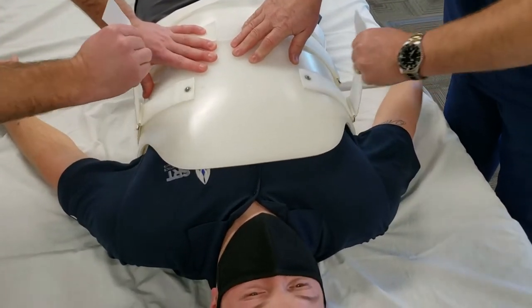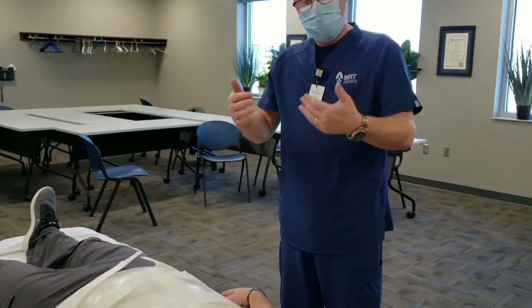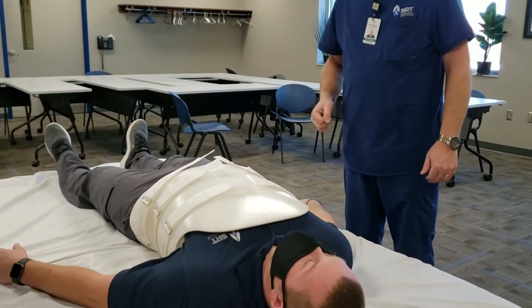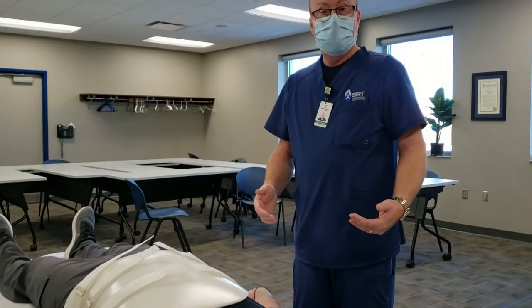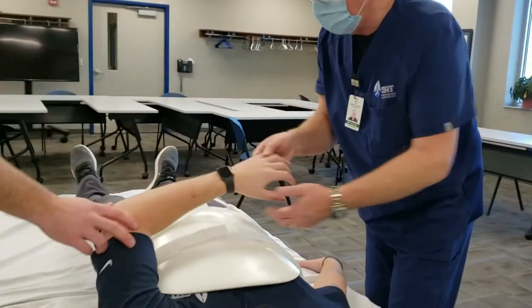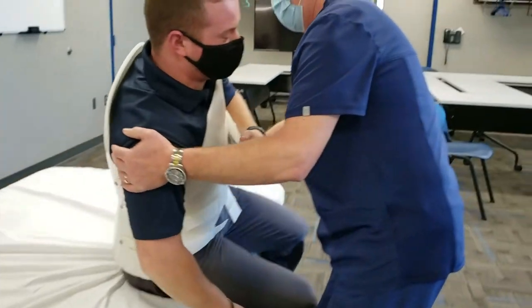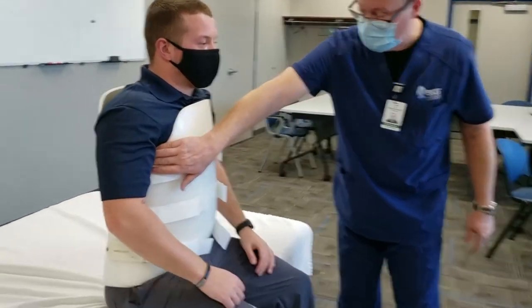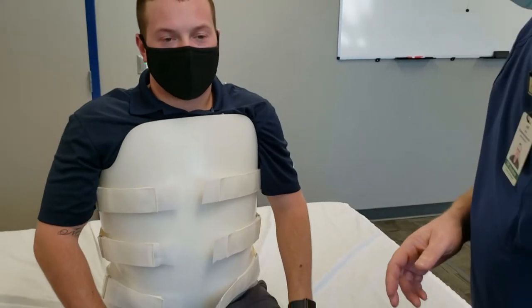Take a breath again. And there we have it. To sit the patient up, we're going to roll him towards me this time. We'll help with his legs off the edge of the bed and then help him sit up. But he needs to do as much as he can with his own strength so that we're not pulling on him. So reach across with this hand, then that knee up — kick your legs off and now sit up. And there it is. Sometimes we have to make adjustments under the arms or on top of the legs, but we'll assess that during this fitting process.